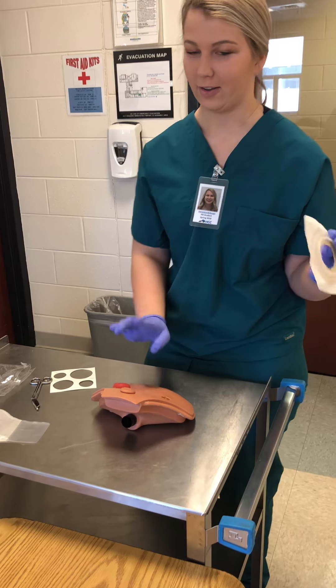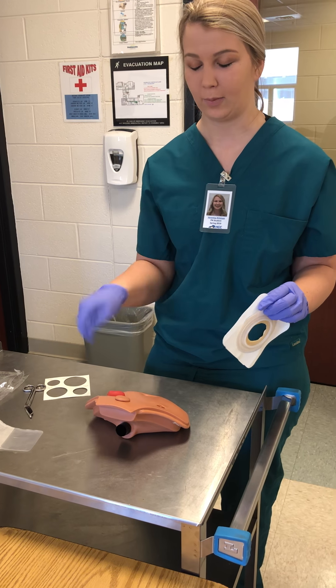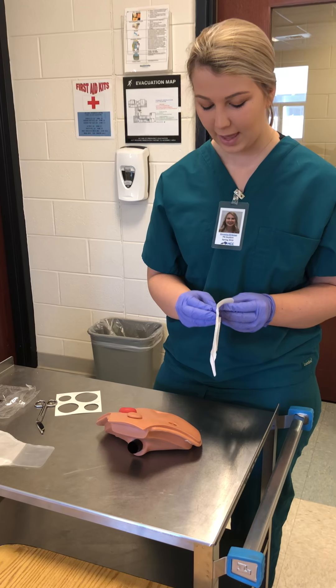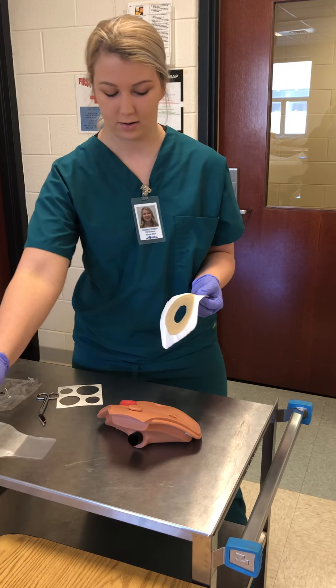Before I apply the wafer, I would clean the stoma off with a damp cloth — just dampen it a little bit, clean the stoma off and clean around it. Then if they want to put a barrier on there, I could do that.